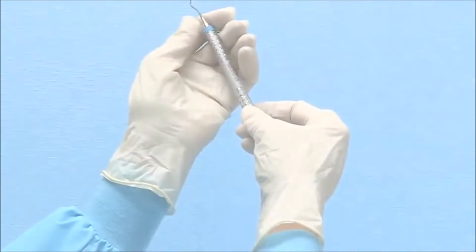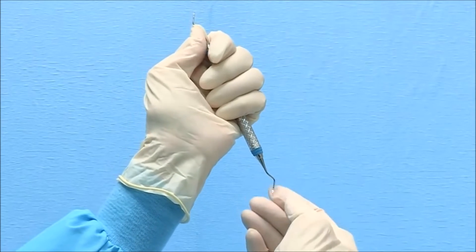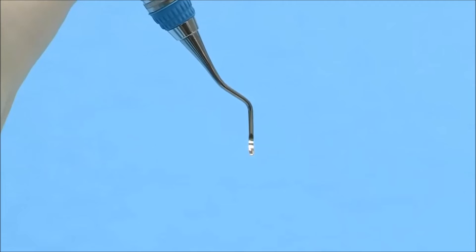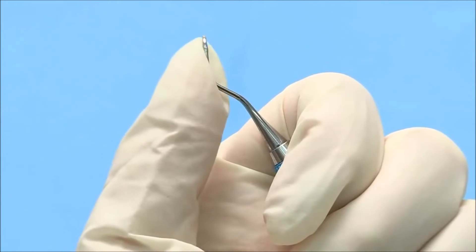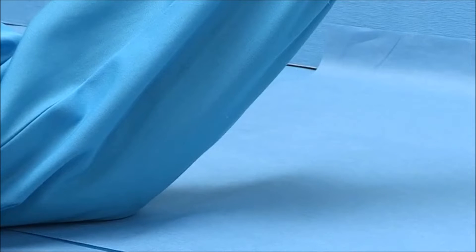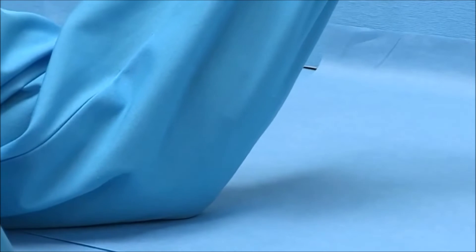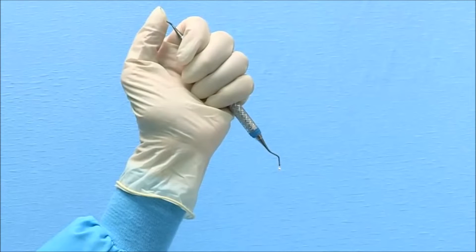To begin the sharpening process, hold the Universal Curette vertically in your non-dominant hand. The blade to be sharpened will be at the bottom with the toe pointed toward you. Brace the top shank with your thumb and place your elbow directly in front of you on the table. This positioning is very important as it will counterbalance the pressure that will be applied when sharpening the lower blade.